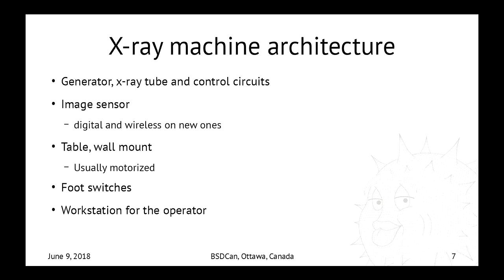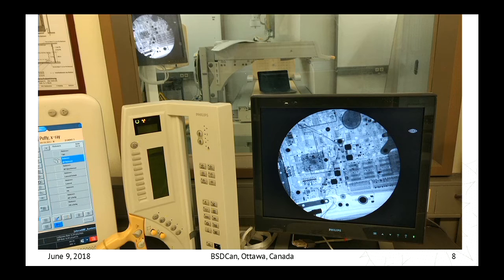We've just been there. Most hardware these days has been software at some point. So what's the difference? There, of course, is stuff like foot switches, very fancy, and a workstation for the operator. That's how that looks. That's one of the labs. The difference to the actual installation in hospitals and doctor's offices is that they have the covers above the machine. There's some covers missing here, because that's their lab. Pay attention to the patient's name.